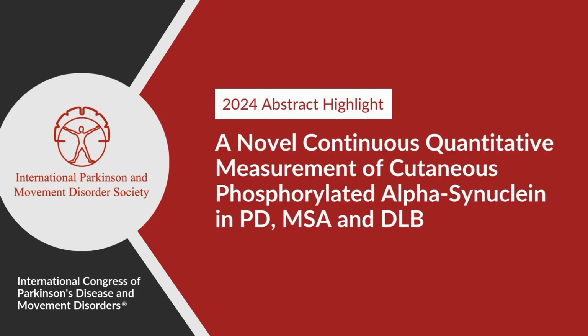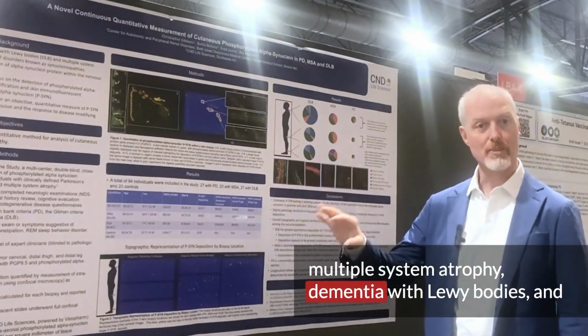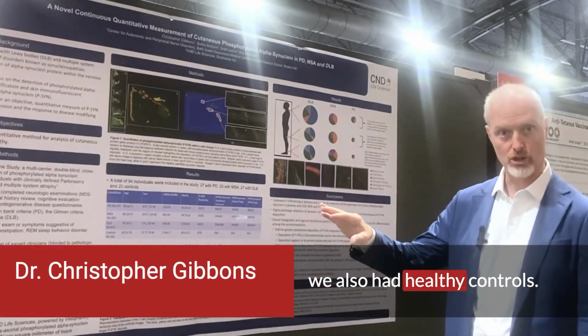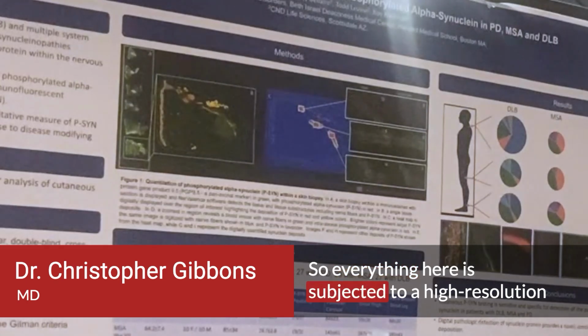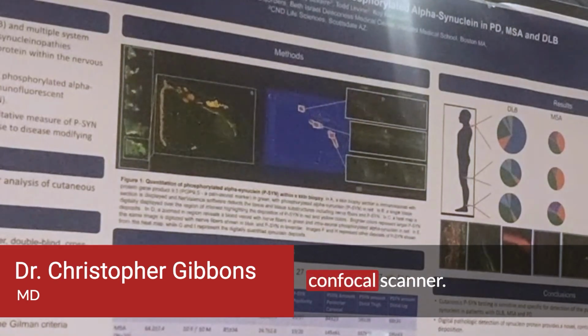Patients with Parkinson's disease, multiple system atrophy, dementia with Lewy bodies. We also have healthy controls. So what we did here is we digitized the entire scan. So everything here is subjected to a high-resolution confocal scanner.